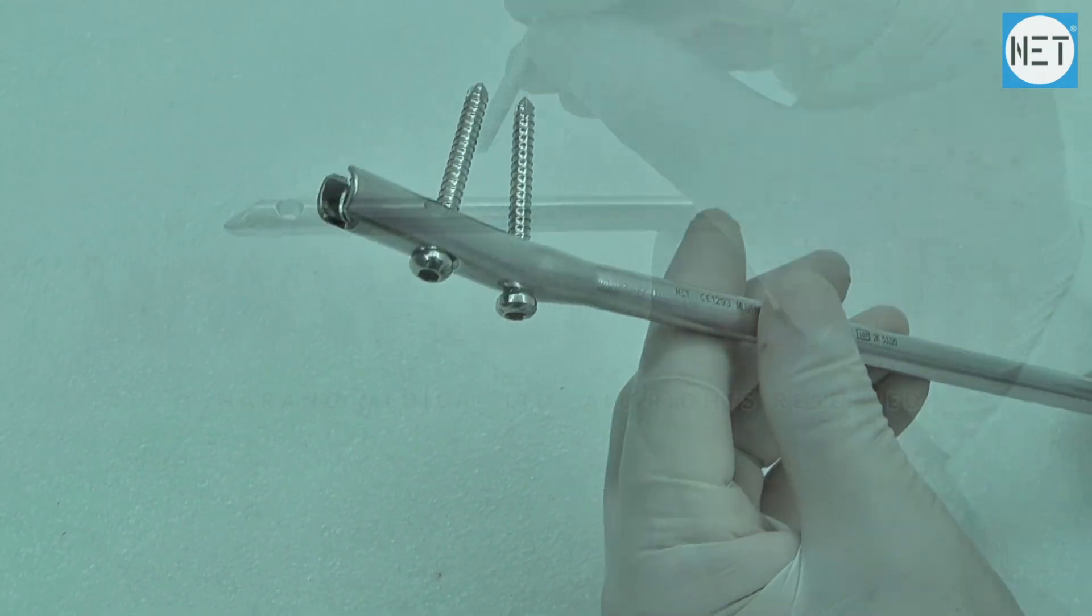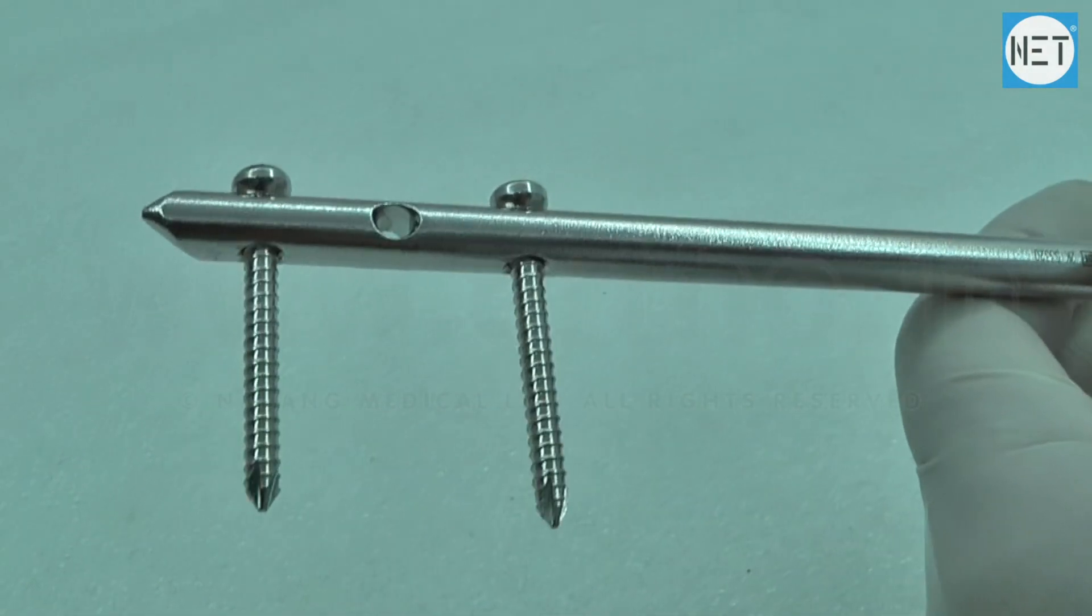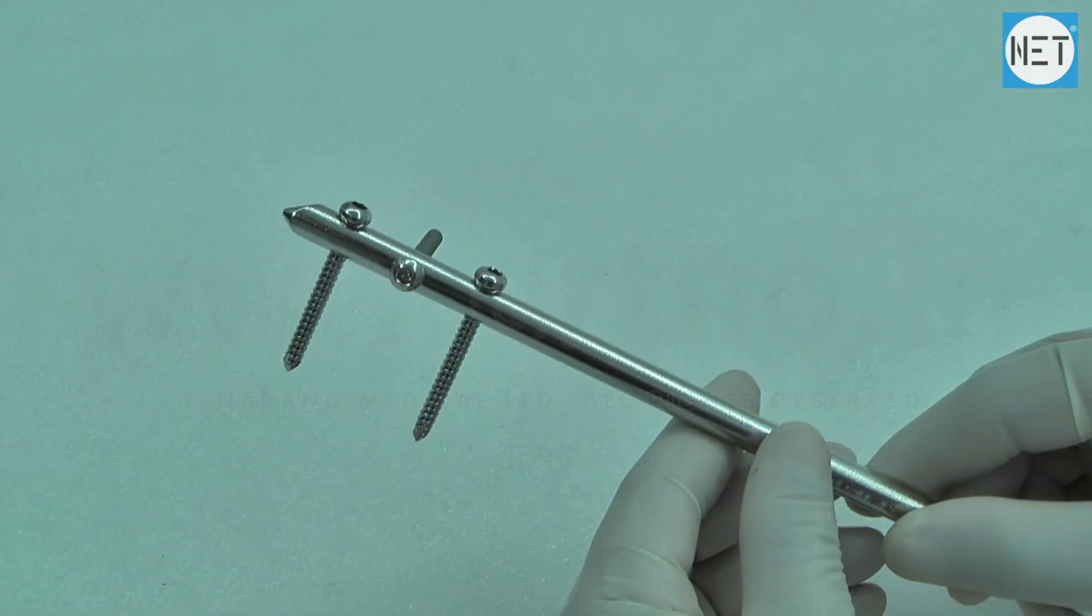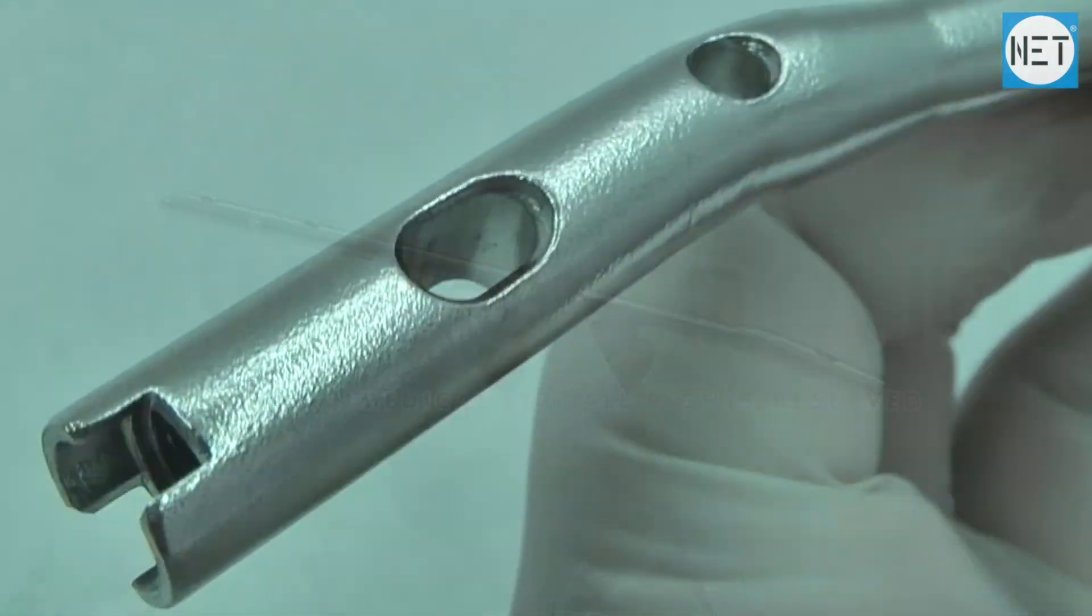First and third distal holes from bottom are directed lateral to medial and second hole is directed anterior to posterior. All holes allow 4.5mm locking bolts. These nails can be used for right and left legs.